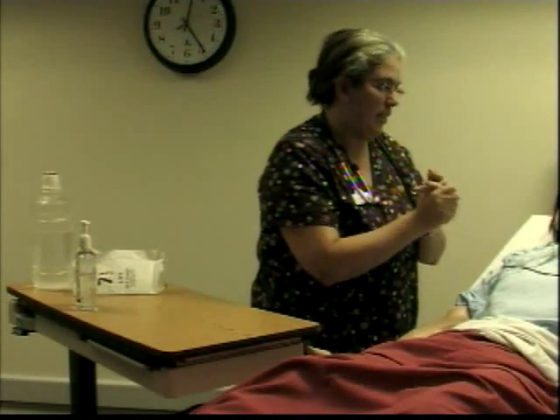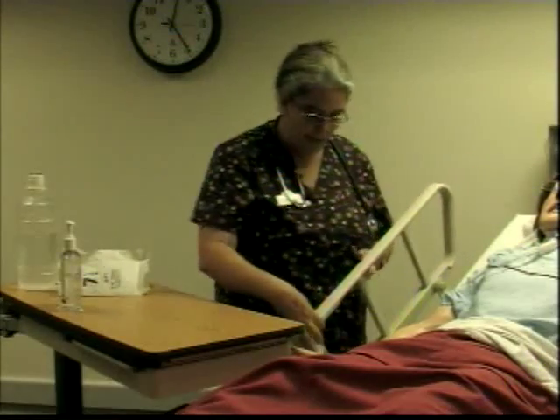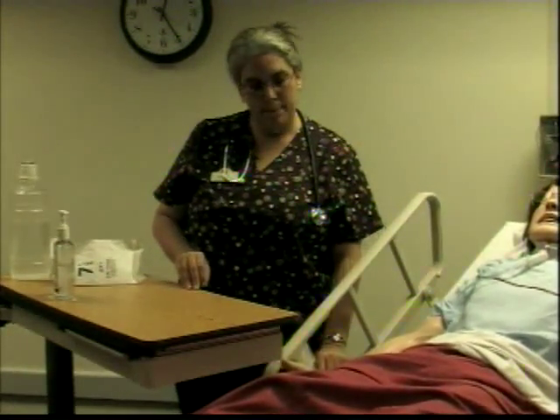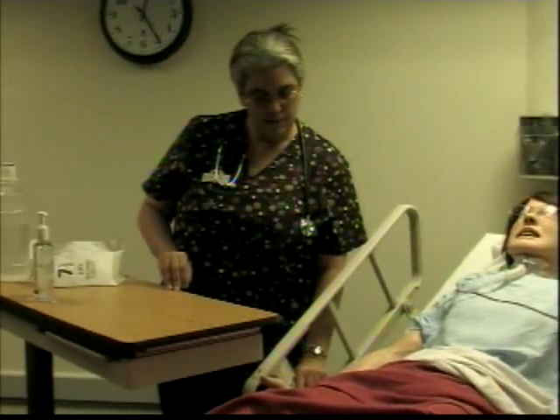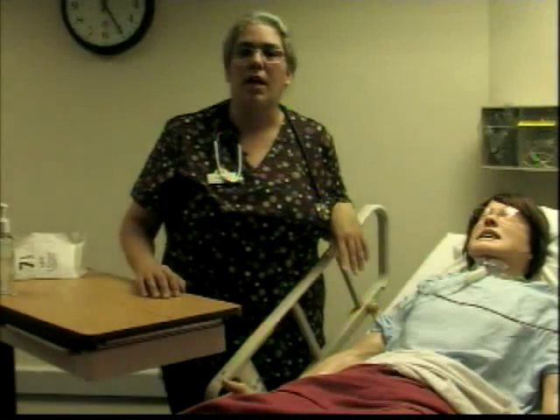You leave your client in a comfortable position. You reassess them again to make sure that there were no differences in their assessment from the previous one. Make sure that they're comfortable, they have the call light. Ask them if they need any help. Make sure that the bed is all the way down. And this is how you'll perform trach suctioning and trach care in a client.